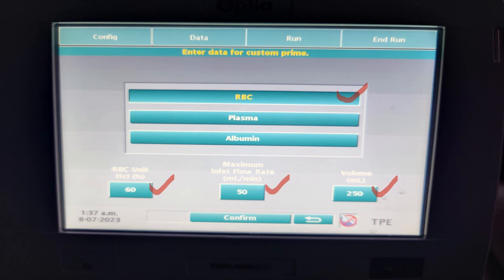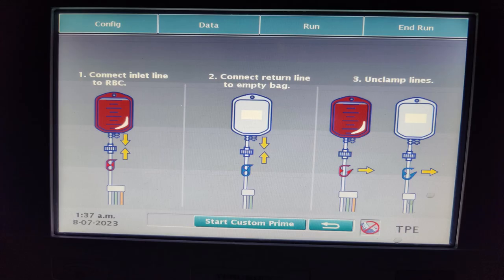Once we confirm, it will show us the circuit that we have to maintain. As we can see, the inlet line depicted by the red clamp is connected to the PRC unit. The outlet line depicted by the blue clamp is connected to an empty bag, and it will ask us to unclamp all the lines.